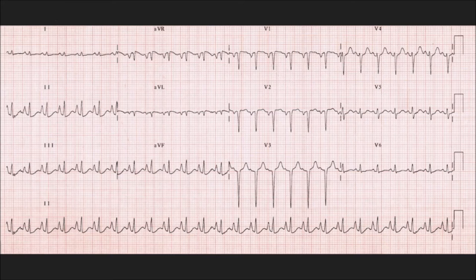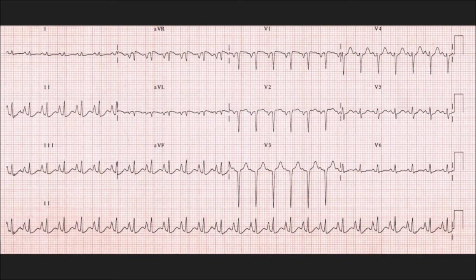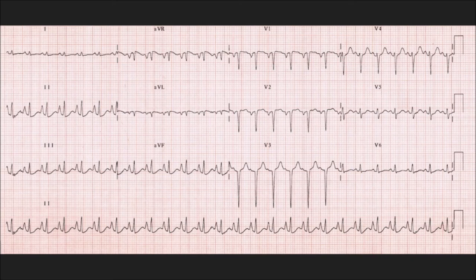Let's look at an ECG. Right here we can see that low voltage QRS as we get to V5 and V6. We can see everything being low voltage in lead I and AVL, which accounts for why the P-waves don't look great there. But then look at leads II, III, and AVF — those inferior leads — look at those P-waves. They almost look like extra QRS complexes.